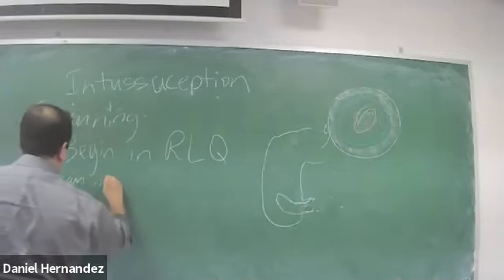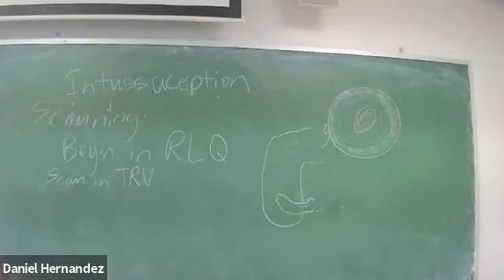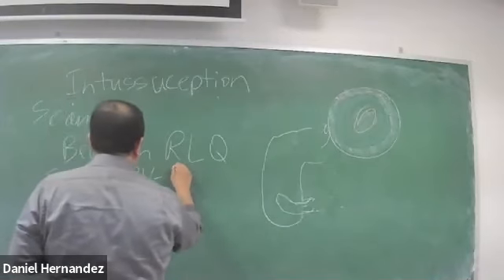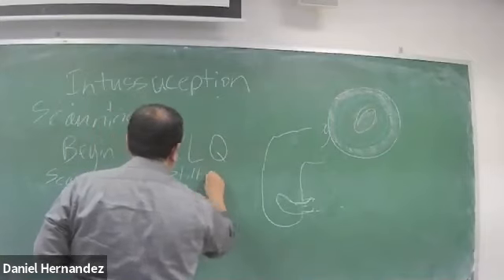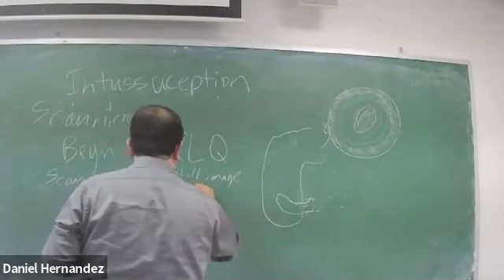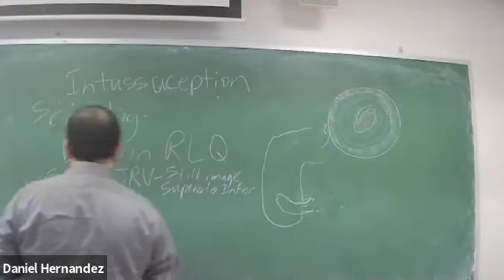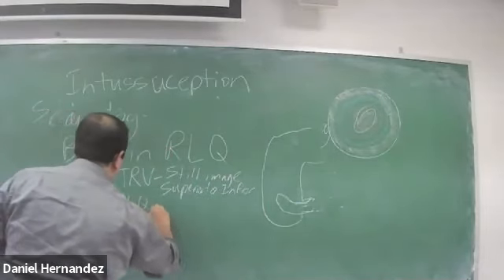Scan in transverse. I will typically do still images, superior to inferior, of the right lower quadrant.